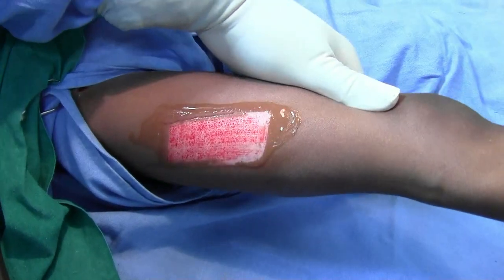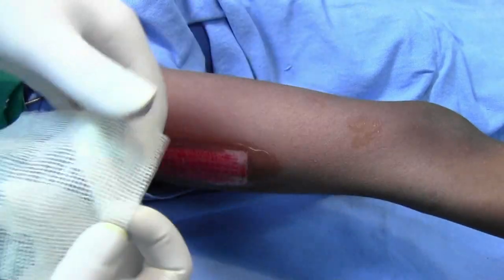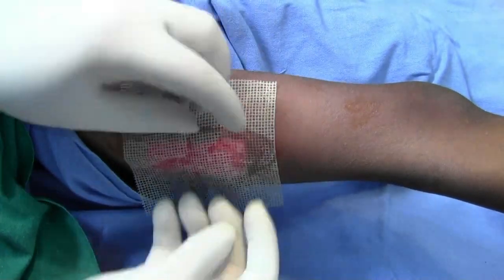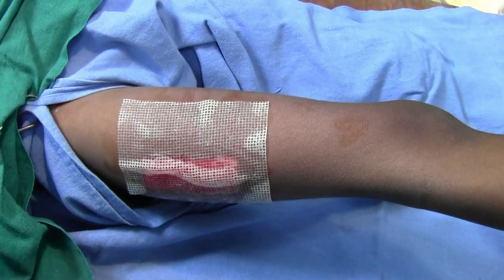Now the quality — I have taken a very thin graft here, and this is the donor area. Just apply plain tulle gras and a pad, and that is all.